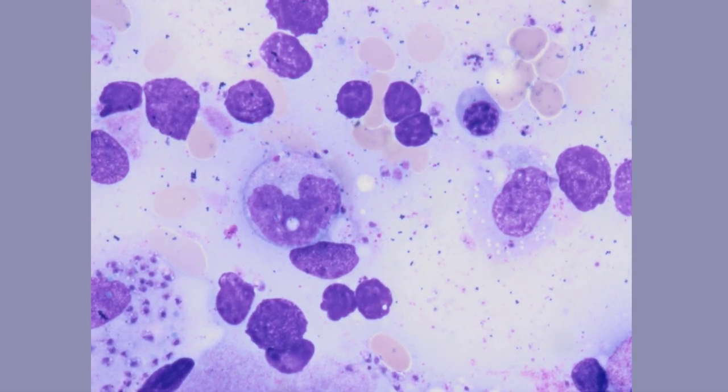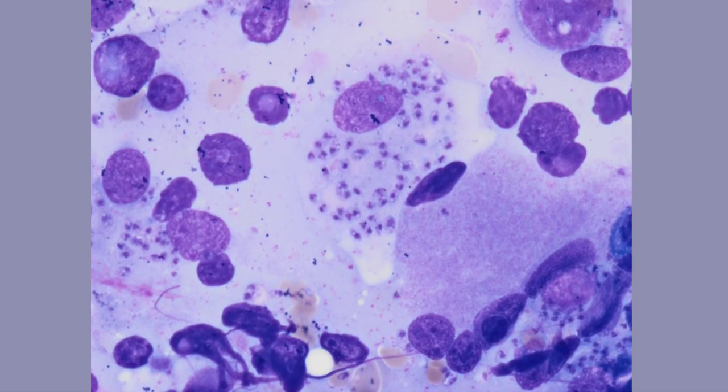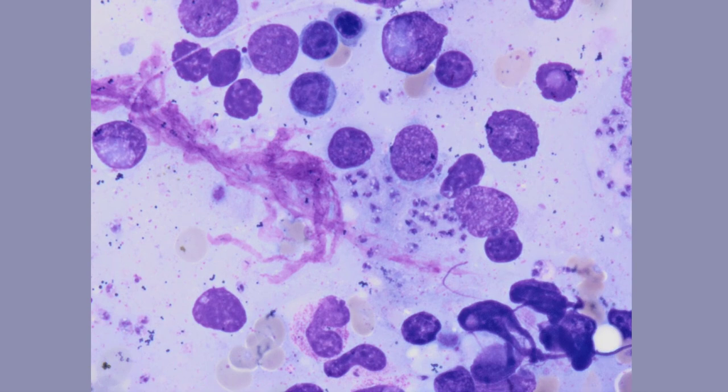These are actually parasites, of course. Round bodies, parasites, consistent with leishmaniasis, and I'm going to tell you why it's leishmaniasis. You can see that they've got these eccentric nuclei. Now the key to leishmania diagnosis is that within these, which are called amastigotes, not only are you supposed to see the nucleus, but you're also supposed to see this rod-like structure, which is called a kinetoplast, within these amastigotes.